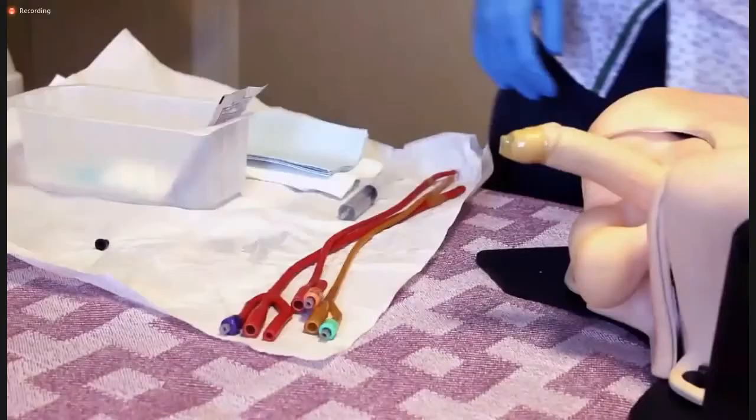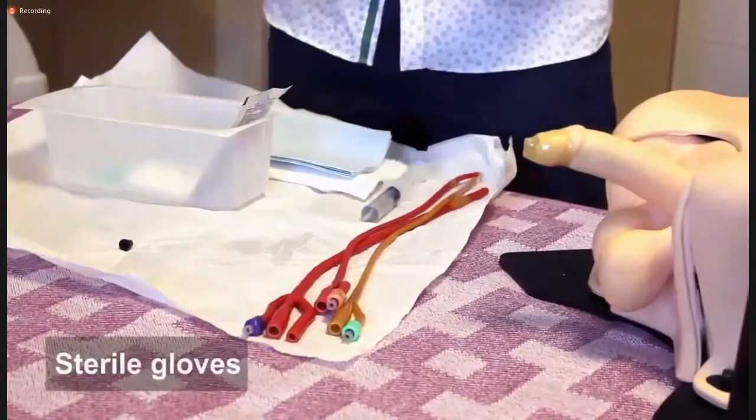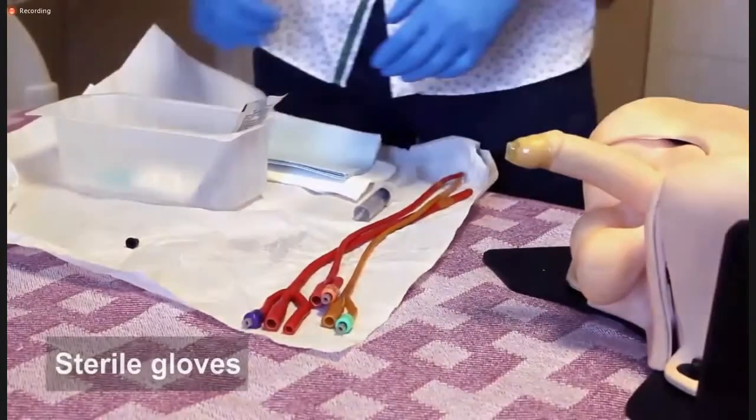So when it's time to put a catheter in, always ask yourself if a catheter is needed. But once you've determined that a patient needs a catheter, you'll need some equipment. So come on over here. In terms of catheterization equipment, you'll need a set of sterile gloves. In this case, it's not completely sterile. You'll also need a sterile drape set.